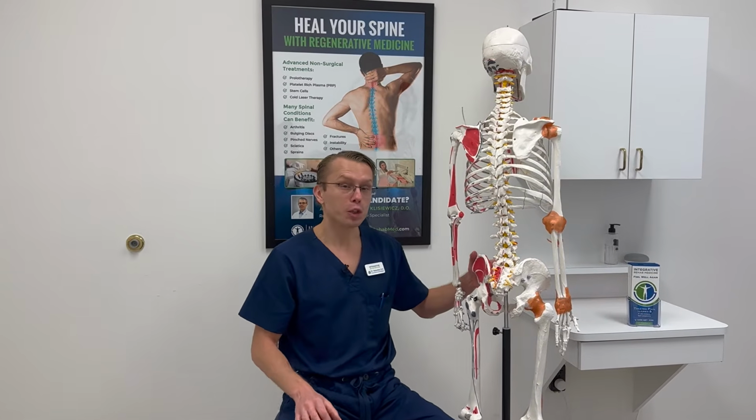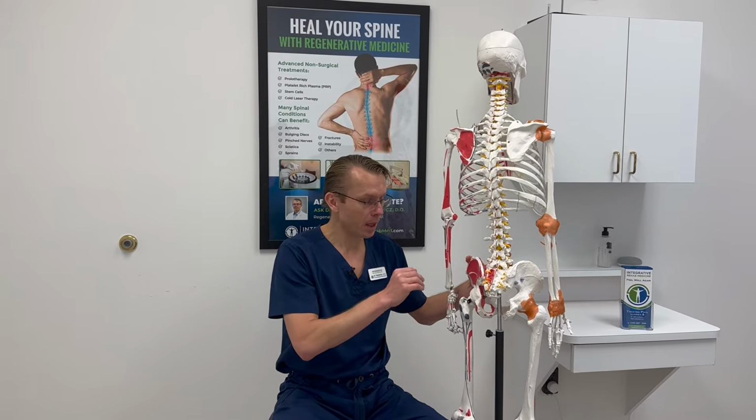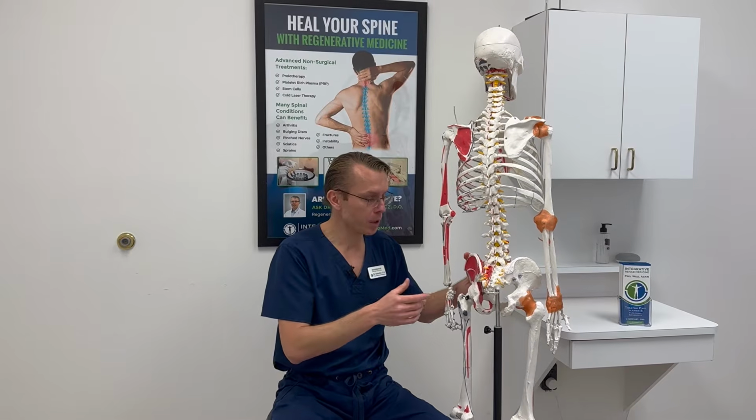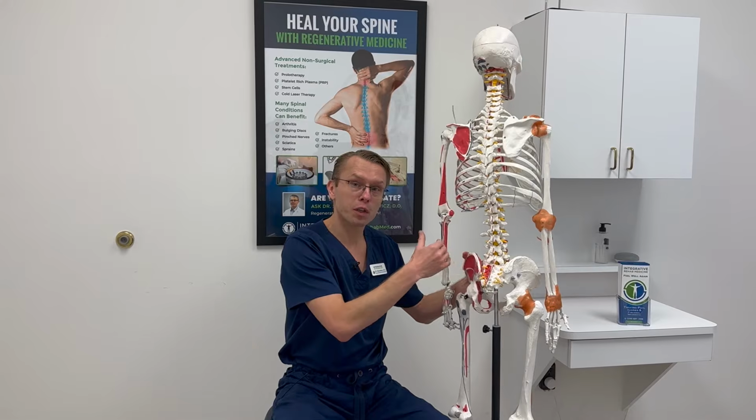Today I'm going to show you how I perform a platelet lysate epidural injection. An epidural injection is used to treat back pain, sciatica, and stenosis. Basically I'm going to be injecting platelet lysate, which is made from your PRP, into the spine, and that's going to cover all the nerves, all the discs, and all the internal structures.